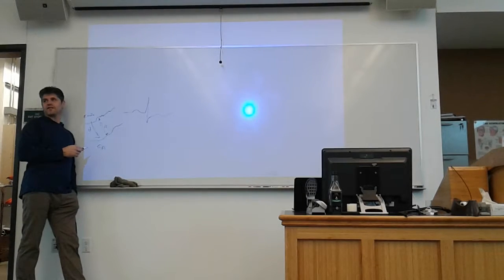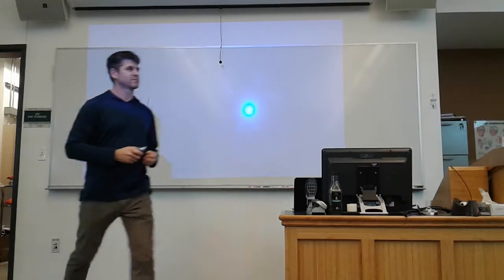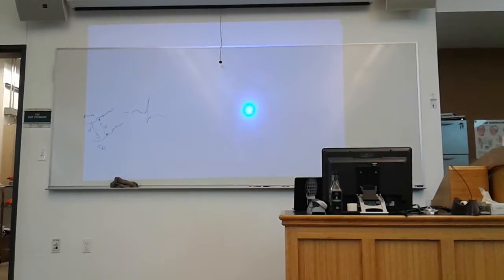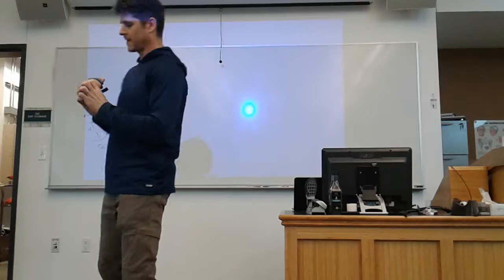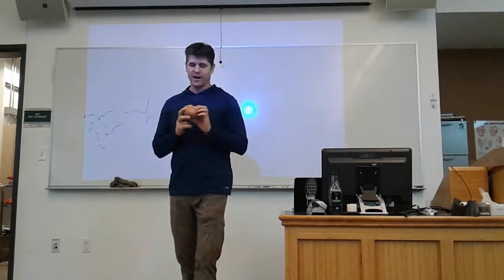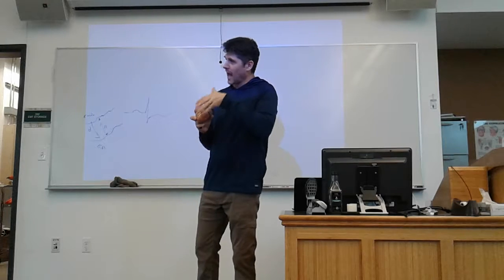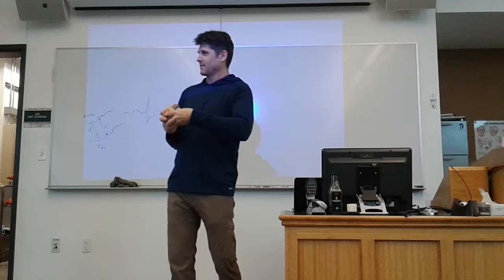Do you understand what he's saying right now? No, you say it again. He's talking about these now. All right, so he's talking about the coronary arteries that are on the outside of the heart that are feeding the heart muscle, right?